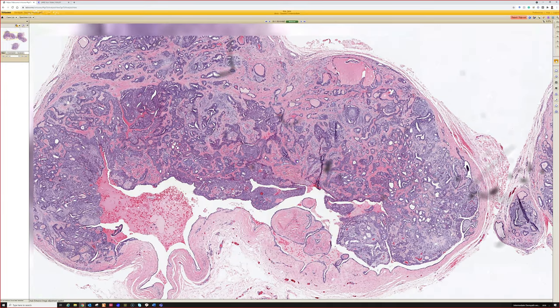And that's not totally surprising because if you think about it embryologically, I'm not an expert in embryology, but from my very basic understanding, the apocrine glands and sebaceous glands come from the same thing as the hair follicle, right? They come from the pilosebaceous unit embryologically, whereas eccrine glands and ducts originate separately. So there probably really is a difference between eccrine tumors and apocrine tumors, with apocrine ones being more able to overlap with sebaceous and follicular differentiation.